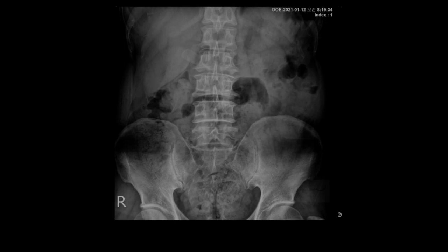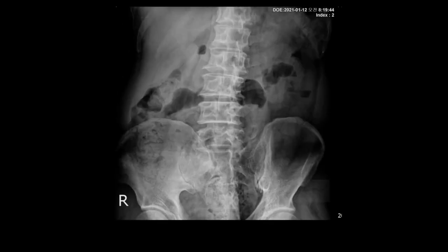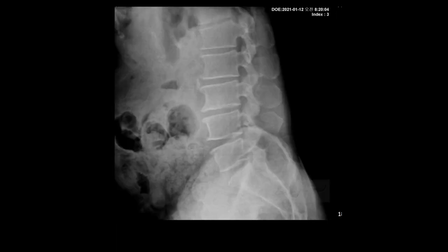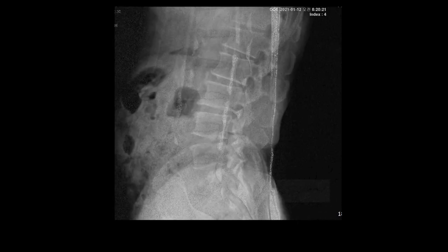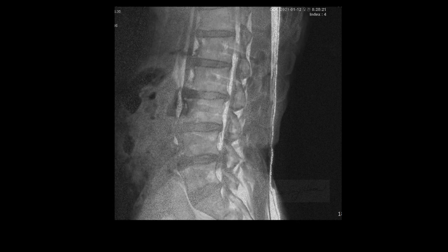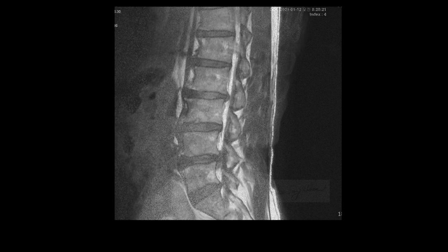Please watch the lumbar x-ray series — the AP, oblique, and lateral views in sustained flexion and extension positions. I can only find mild degeneration of the lumbar spine. There were no specific findings.